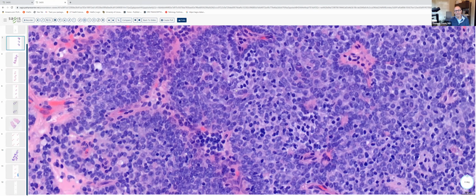These cells have some faint eosinophilic to pale gray cytoplasm, although the cytoplasm is kind of difficult to see. And some of these cells have an evenly dispersed or vesicular chromatin pattern, and other nuclei are a little bit darker staining. But these two dark and light staining cells are about the same size.